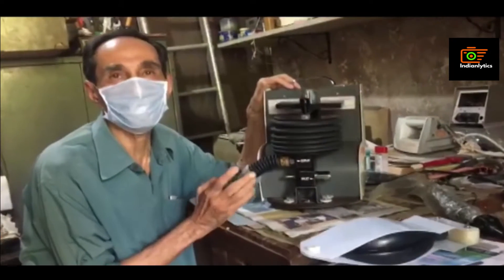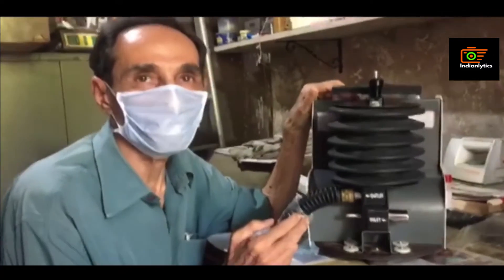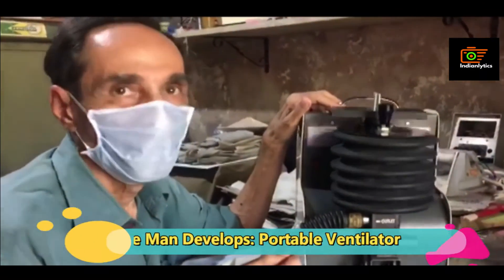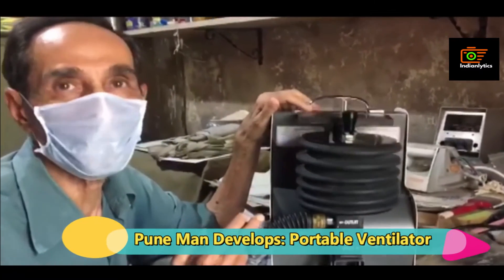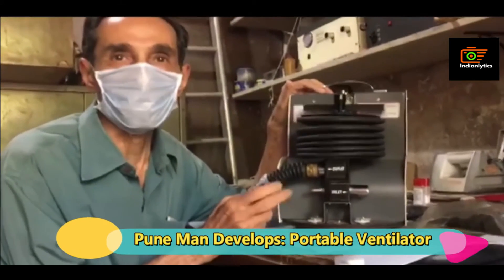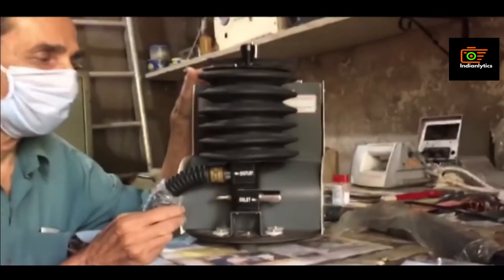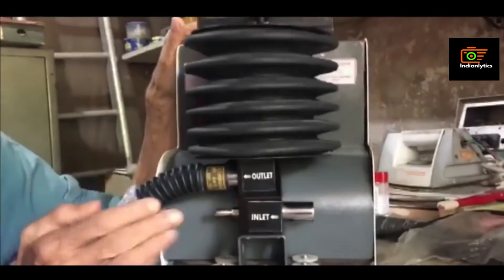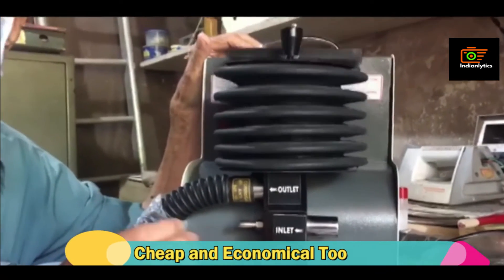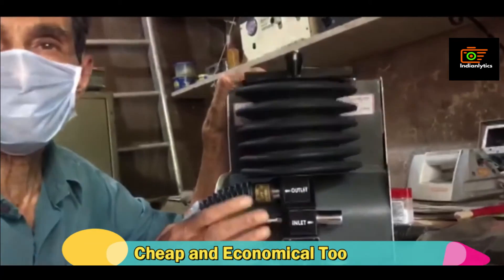This is the smallest and the simplest ventilator, which will be useful for COVID-19 patients. It works on a simple electric motor which consumes just 50 watts — the power consumed by one tube light. It will work on and on without any fault because inside it is very, very simple.